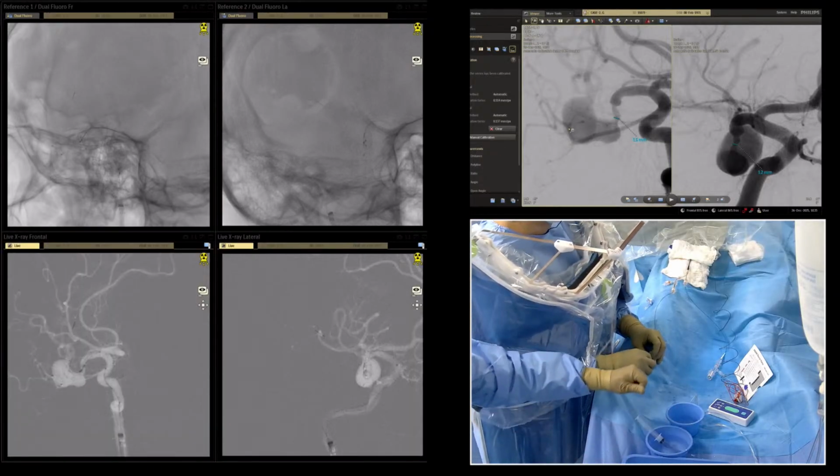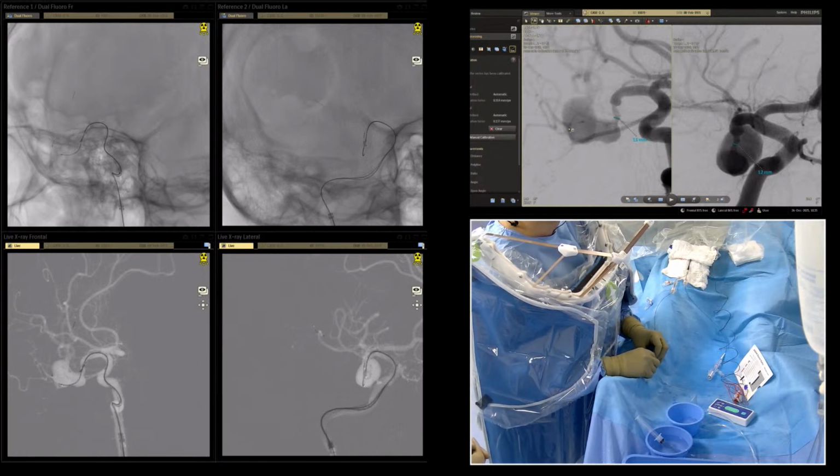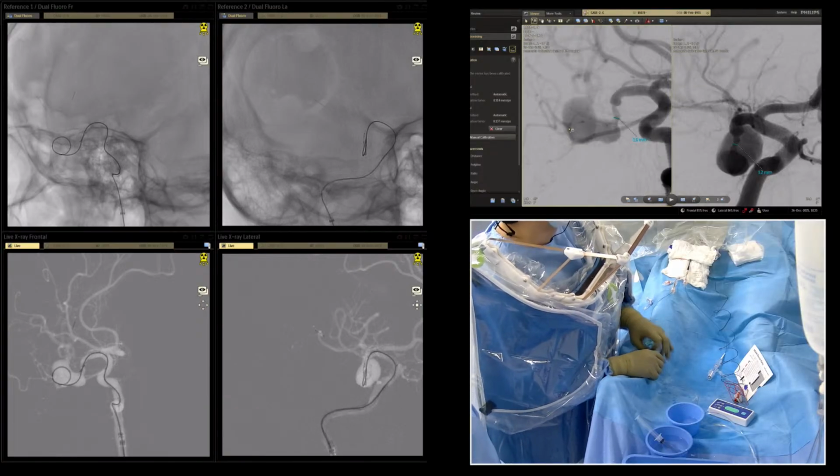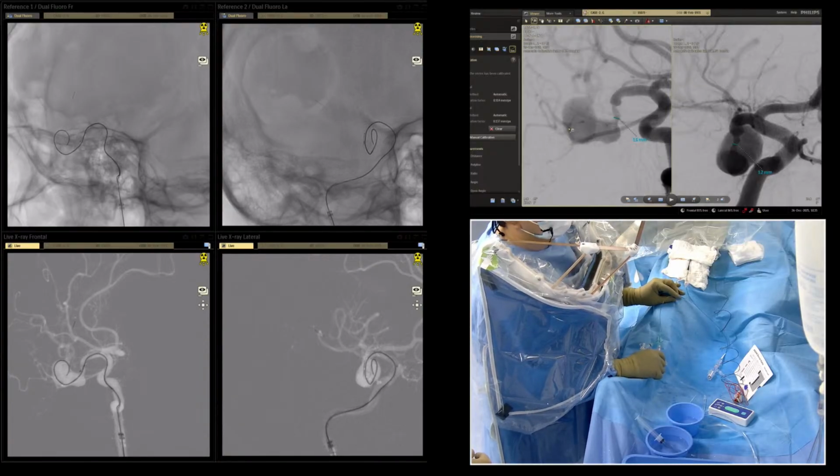The first coil is Microplex 6 at 10:30 something. It's very important not to go through the stent. I'll bring the balloon a little bit back and then can place the... Yes, it's around the stent, not inside. It's very important.